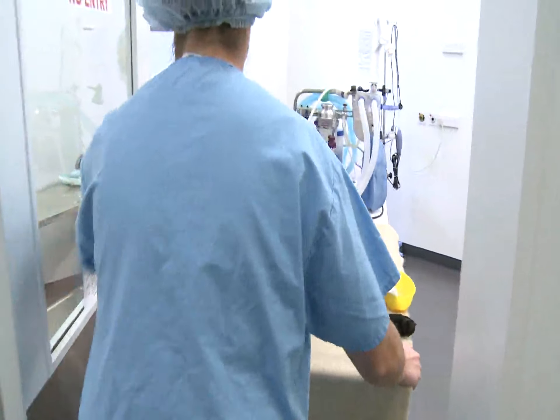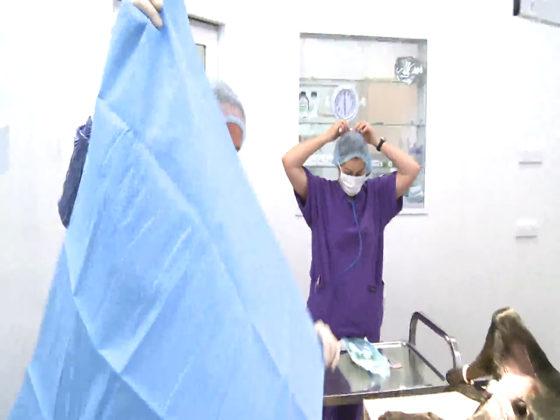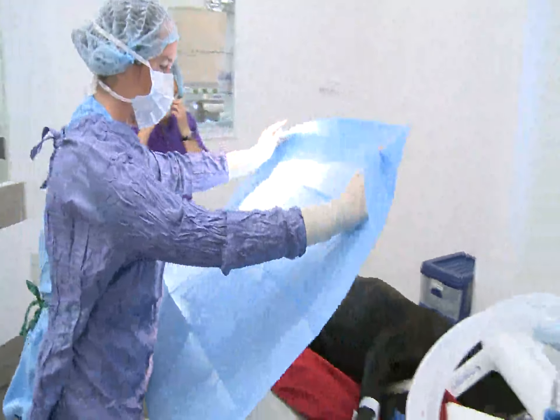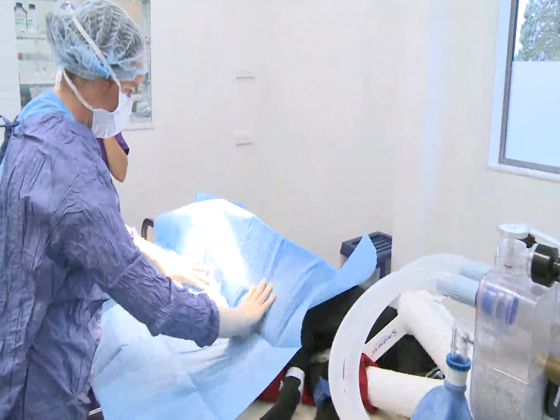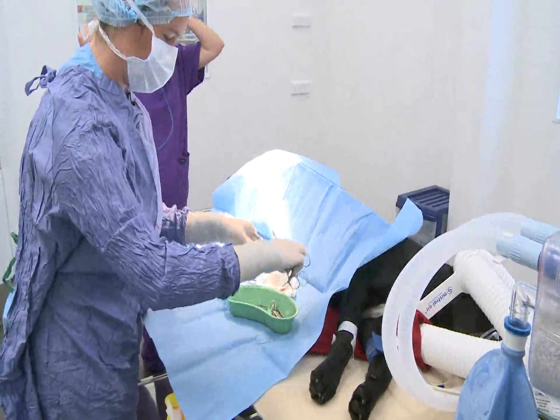So we'll take him through into theatre now. First of all, we need to put a drape over our patient to hide all the other unclean bits. This is my surgical kit that I'll be using to do the surgery.